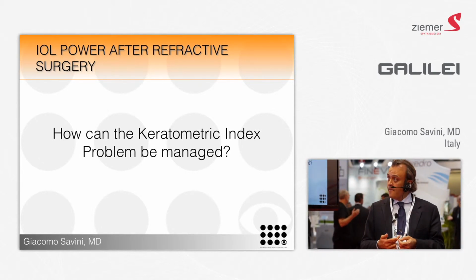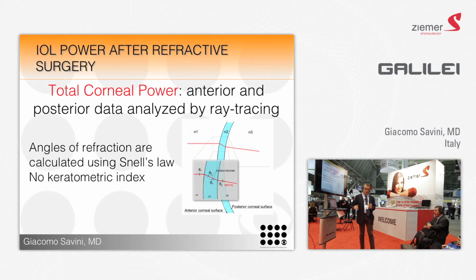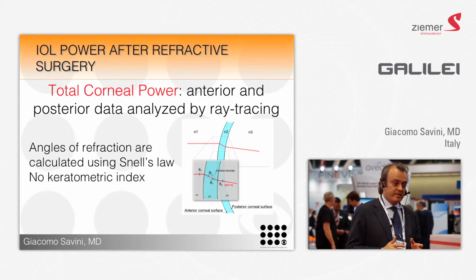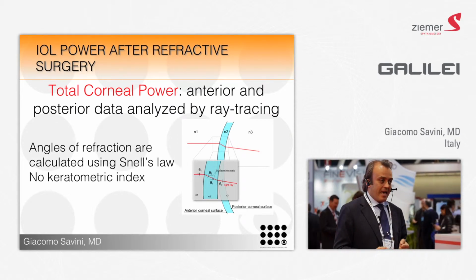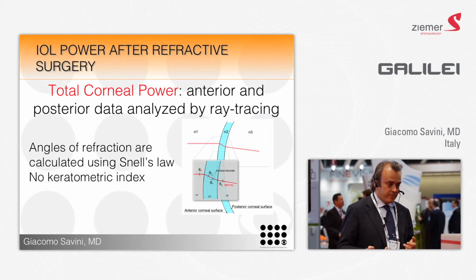Now, how can we manage the problem of the keratometric index? We should eliminate the keratometric refractive index for eyes that need cataract surgery but had undergone LASIK or RK or PRK.